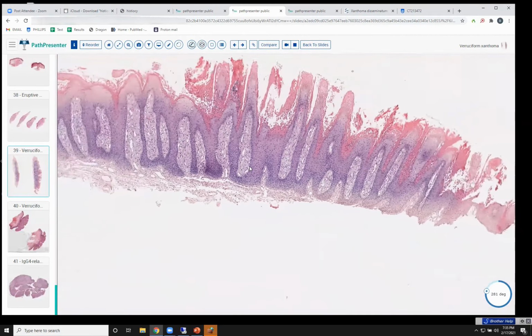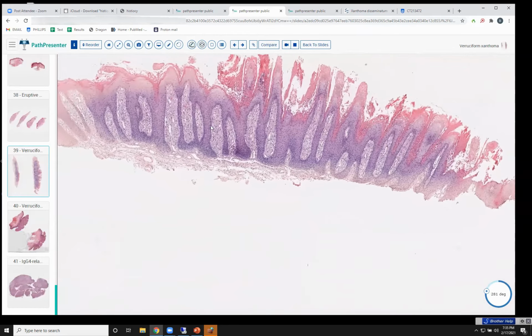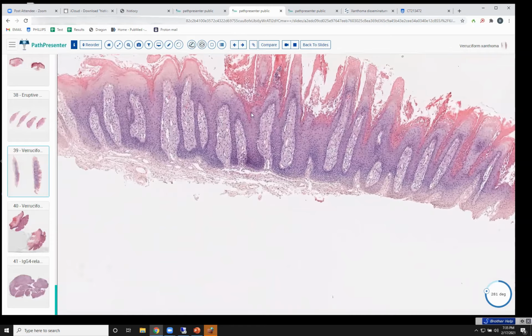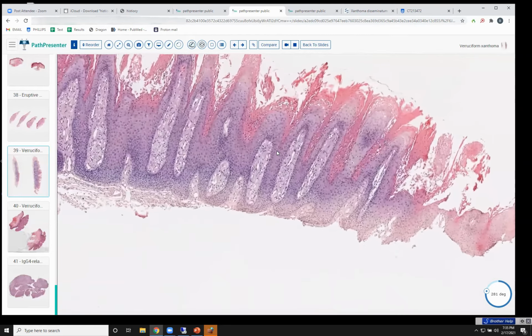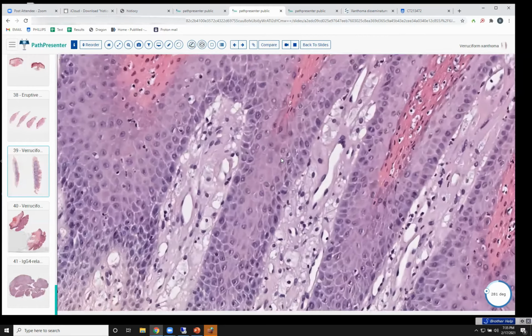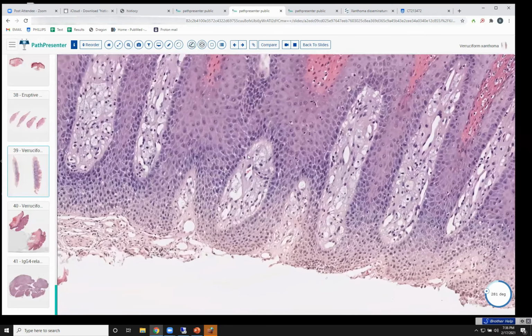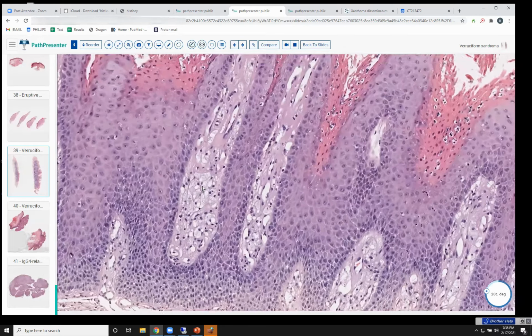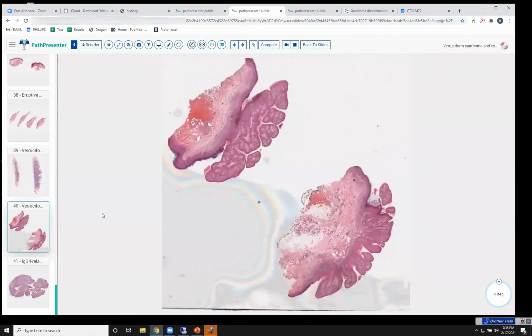And once you've seen this a couple of times, you look at this and you think, oh, could this be porokeratosis? But it's not, because there's no dyskeratotic cells underneath the column of parakeratosis. And you just look at this and say, oh, verruciform xanthoma. And these, as you know, you can find in the oral cavity, on the scrotum, buttock, and it's a very nice slide for the boards.